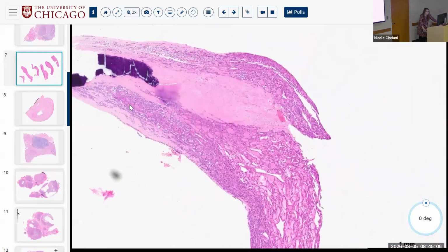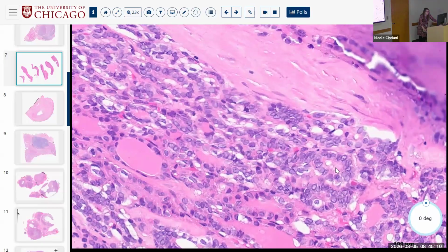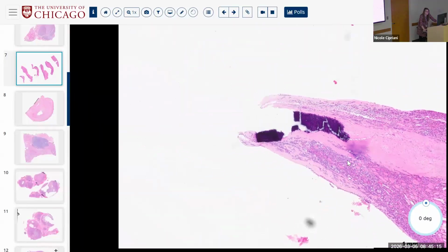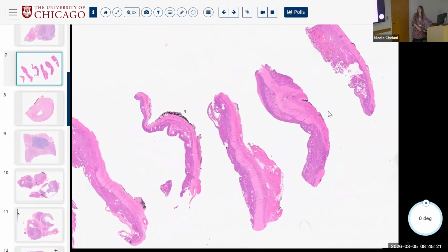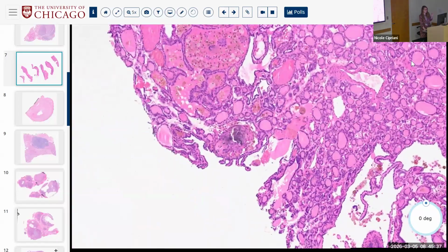What do you want to do? Was this FNA before? It was. Do we have molecular results on that? We do. What did it show? BRAF V600E. Okay? So these are rare, right? These are very, very rare. But the completely follicular patterned BRAF V600E PTCs do exist.